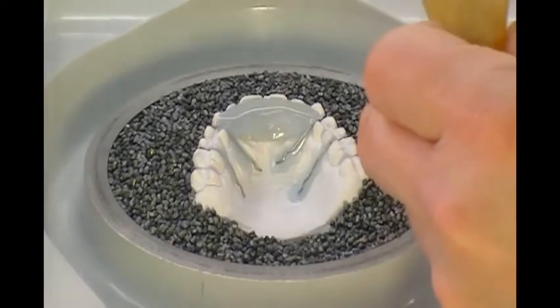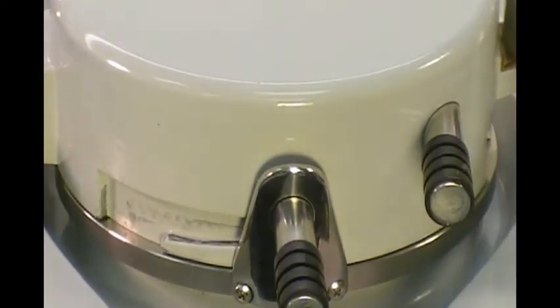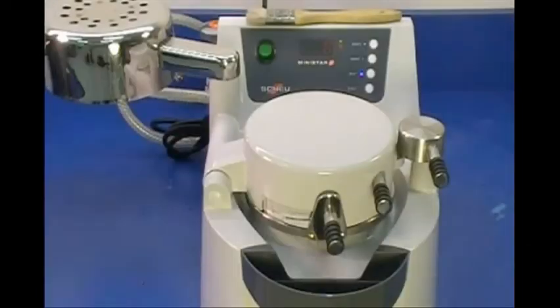Once the heating time has ended, swing the lamp to the back of the machine. Then rotate the chamber over the cup and lock into place. Allow the formed material to cool and acrylic to cure for 2½ to 3 minutes.